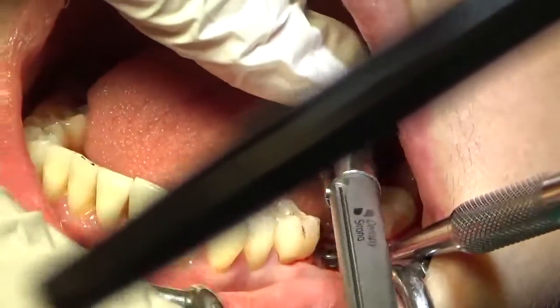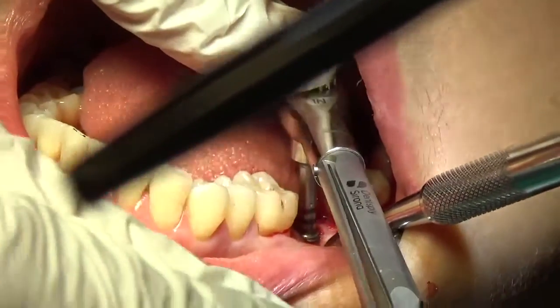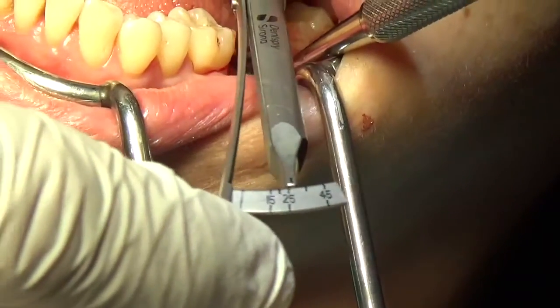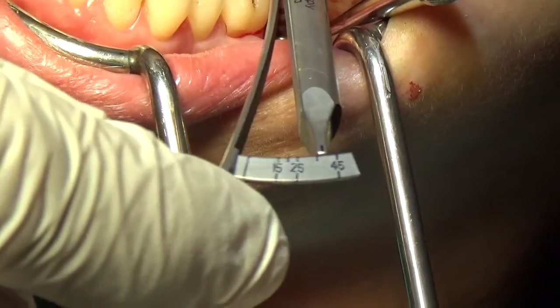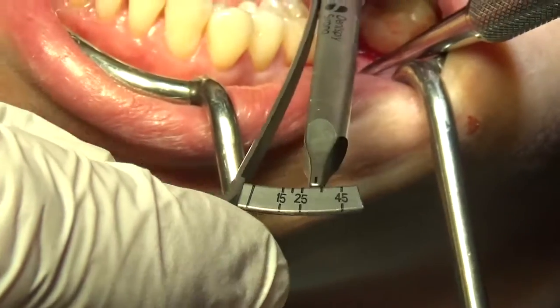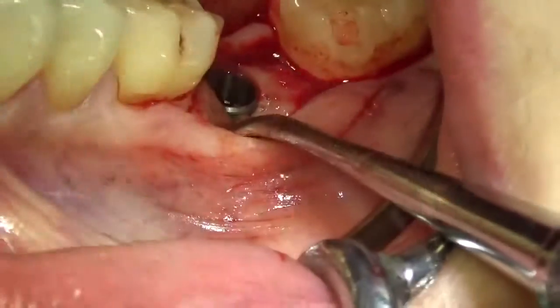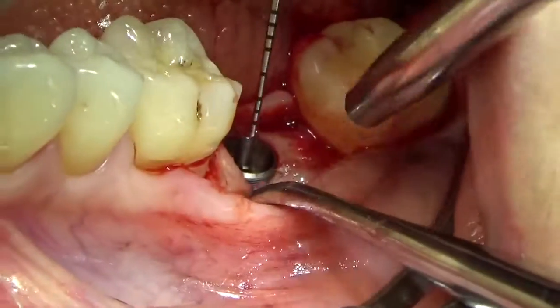Right at the top, having it engaged, and can you see the torque right there, Angel? So we have good torque there, somewhere around 40 Newton centimeters before it goes. Around 40 Newton centimeters. Okay, so coming from the buckle, what are we seeing?